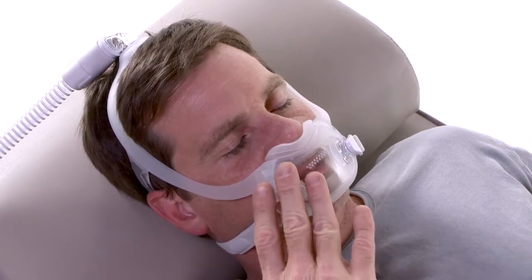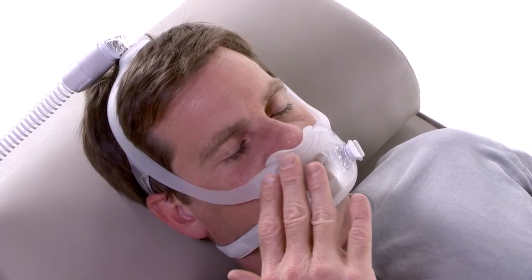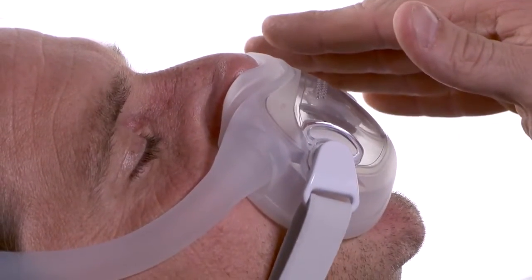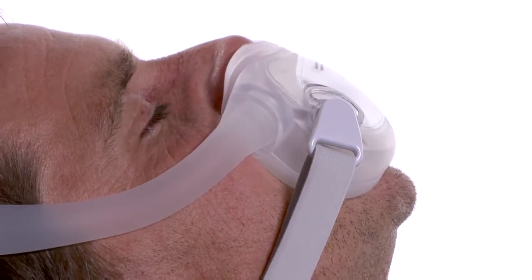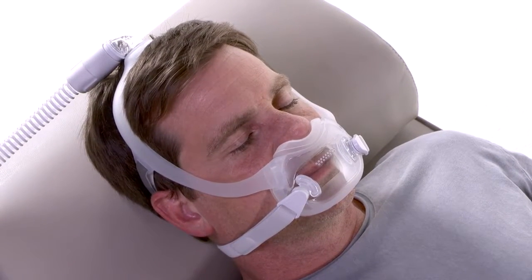You should feel air escaping from the holes in the front of the mask, which must be left open to prevent re-breathing. Never over-tighten the headgear. If too much air is escaping, try another cushion or frame size.